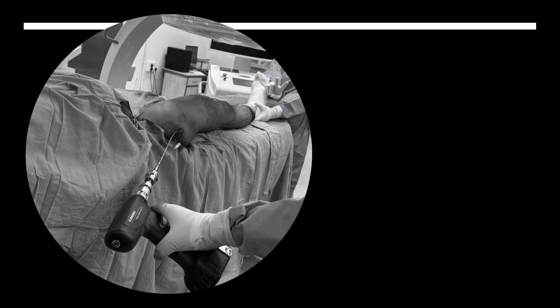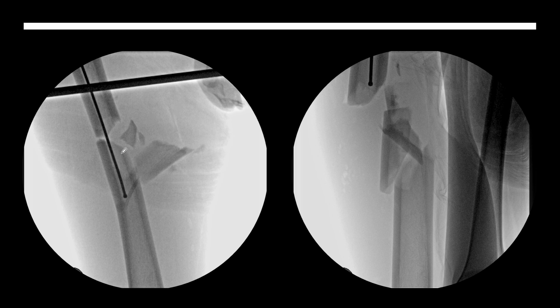Reaming is also not an issue. Once you have placed the guide wire and replaced it with a flexible long guide wire, reaming can be initiated. Your assistant can simply apply slight traction to reduce and keep the limb in alignment, then you proceed with the reaming process. Reduction is not an issue — with traction, the vertical alignment is satisfactory. You can push or pull the distal fragment according to requirement to align the fragments. However, in the lateral view the proximal fragment is usually flexed. You can simply push this proximal fragment downwards, or alternatively place a bolster underneath the distal fragment to align it with the proximal fragment.